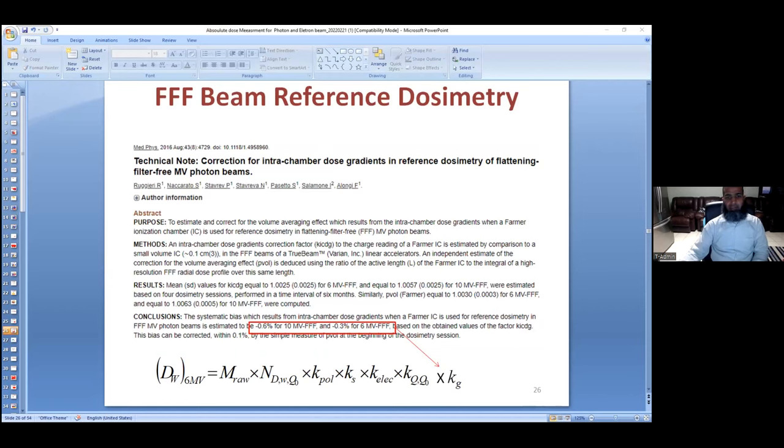Okay, so they did it actually, and they found an additional factor to correct these uniformity correction factors. Even if you have done the uniformity correction factor when you're doing an in-air measurement for the brachytherapy air kerma calibration, there is a factor which is called the uniformity correction factor.